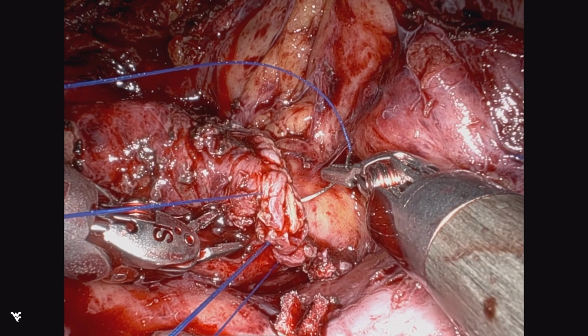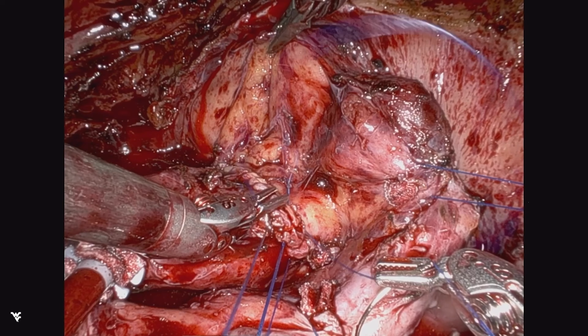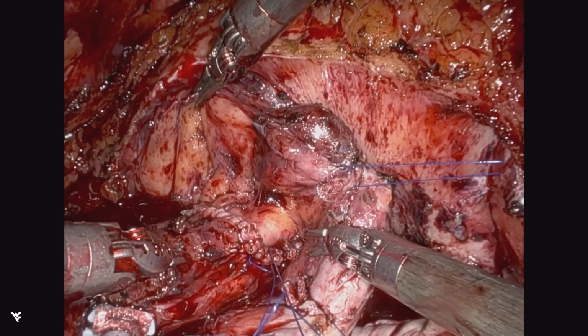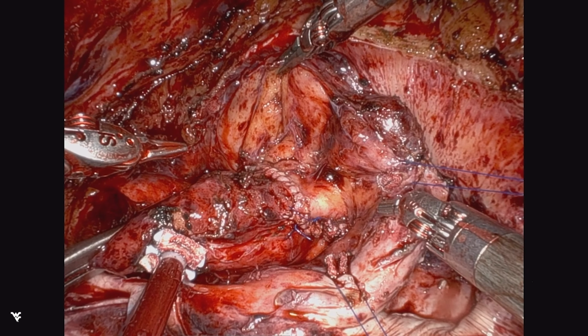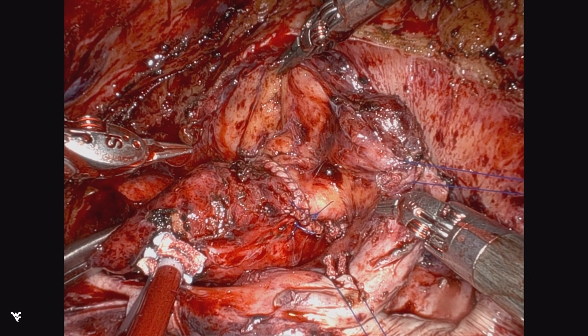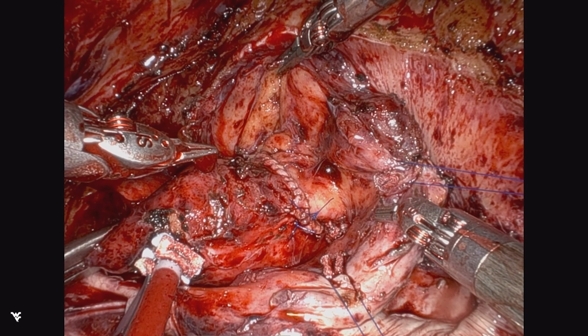If pledgets are used in your institution, that is totally fine. Whatever is safe and whatever is routine, this technique is very adaptable to whatever situation you so choose. So this RAVR is now complete, despite its complexity, with an excellent overall result.